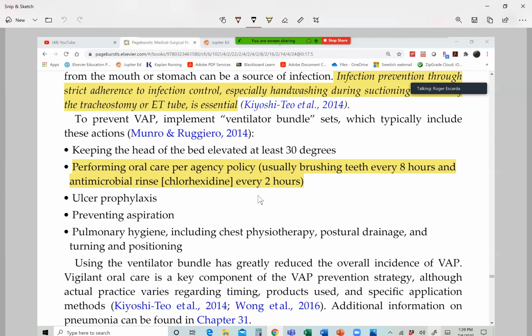So let's say this is Michael, and this is the airway. Now the tube, remember the ET tube, let's say this is the cuff, and this is his airway. There are secretions here, above the cuff, and this is the tube. Before you deflate the cuff, make sure you suction this area first, because we have secretions trapped in there too.